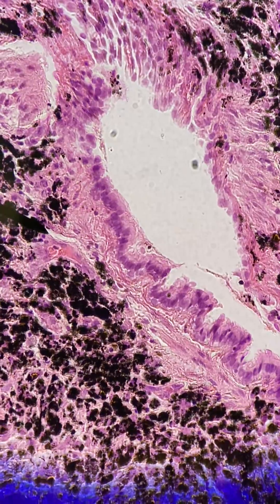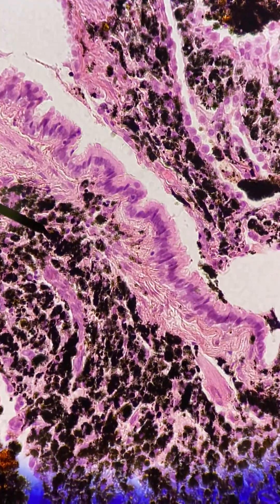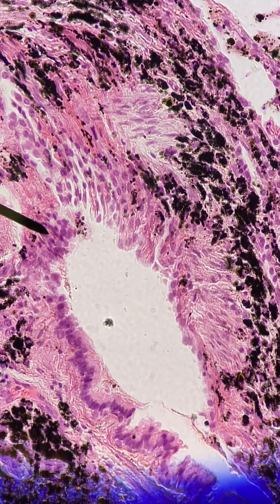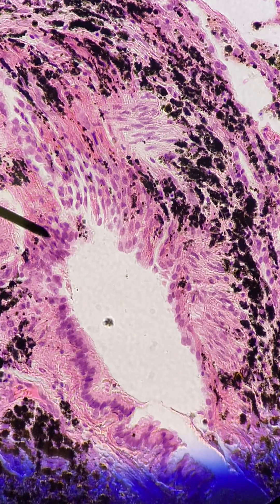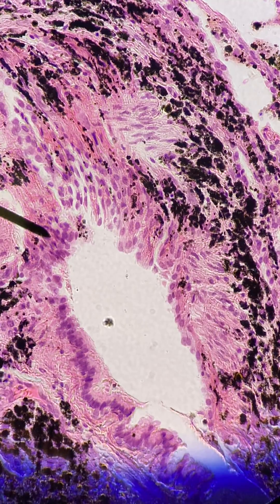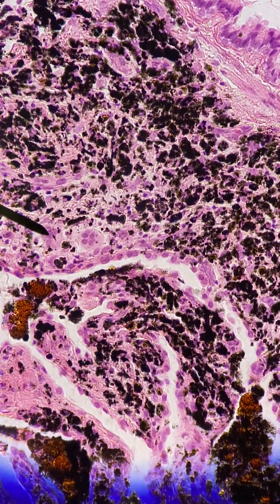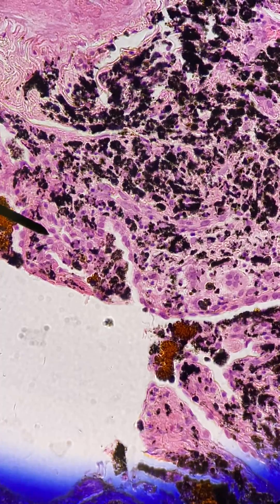There's lots and lots of this black particulate matter. When you smoke, you're breathing in this burnt plant matter and it sticks to the mucus inside your lungs, which you produce to trap stuff. It traps it, but if you keep smoking you end up paralyzing the cilia that are supposed to move it out, so you just deposit more and more of it. There are carcinogenic substances in there that'll eventually give you cancer.